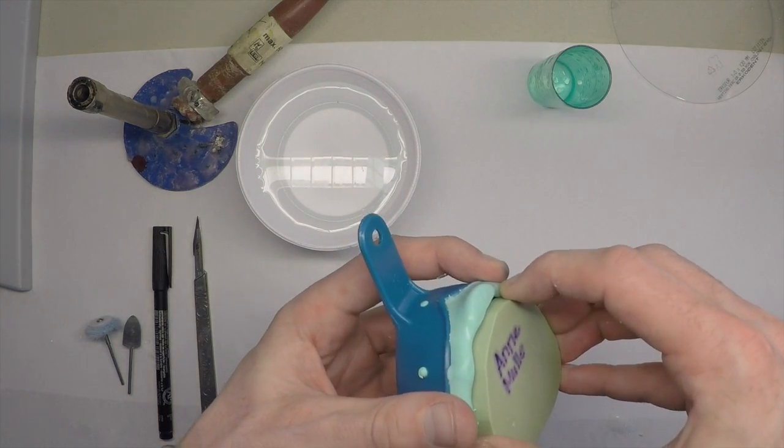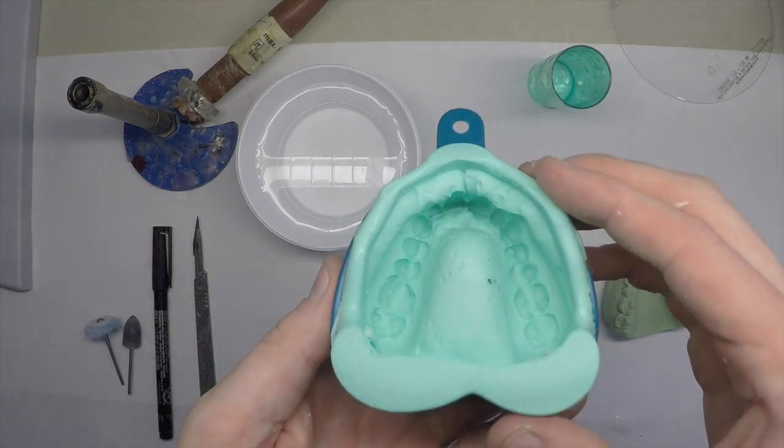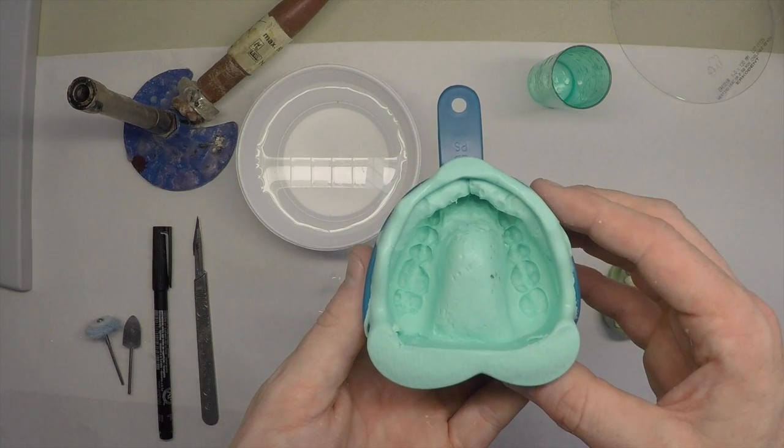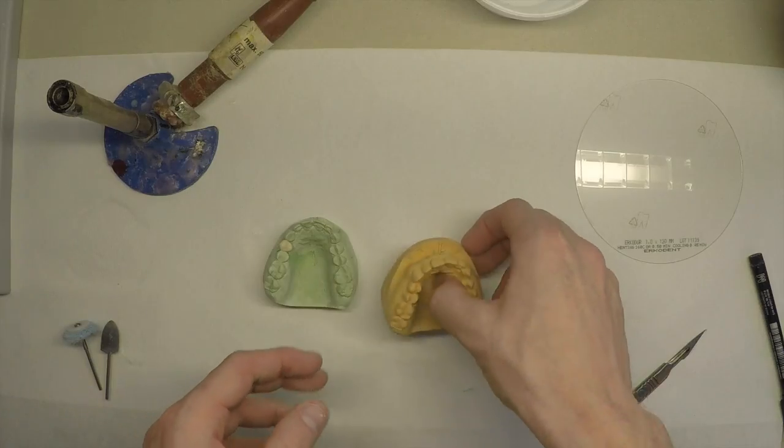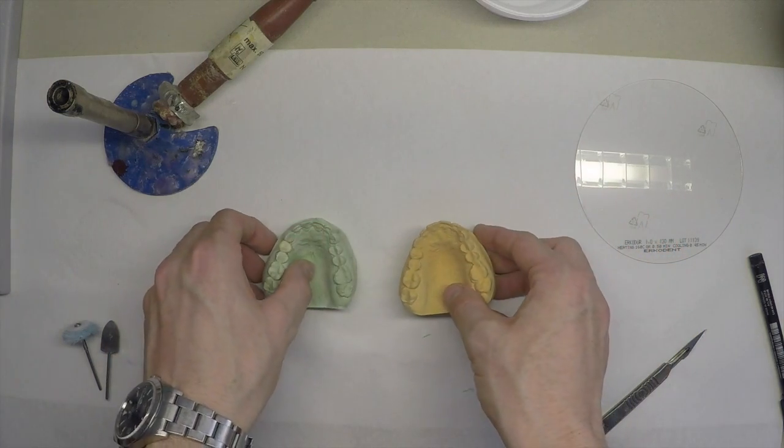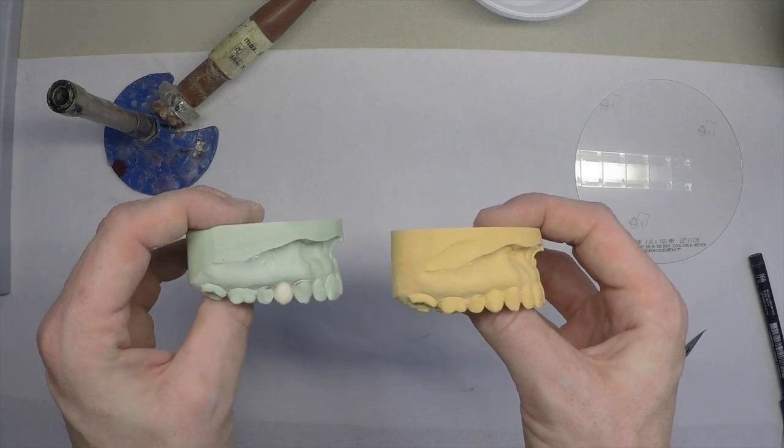Gently remove the stone model from the alginate impression, and now we're ready to pour that in type 3 dental stone. Once we've poured up the duplicate alginate, we have a duplicate model of our wax up.